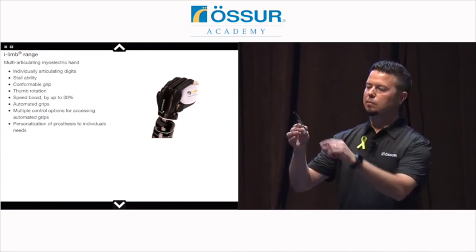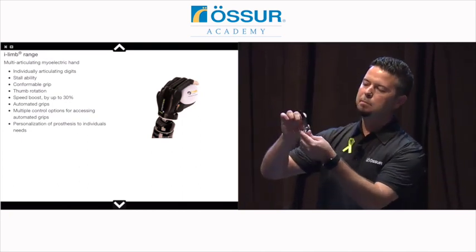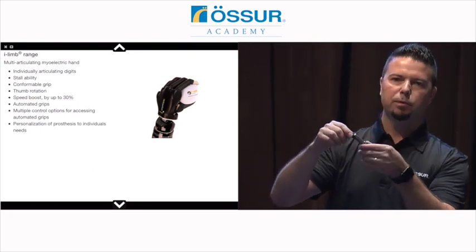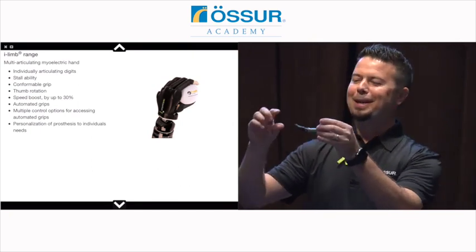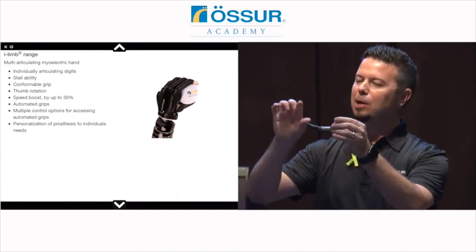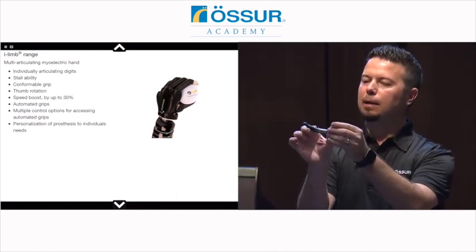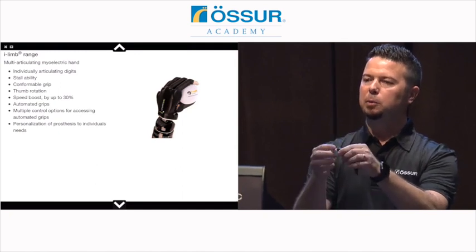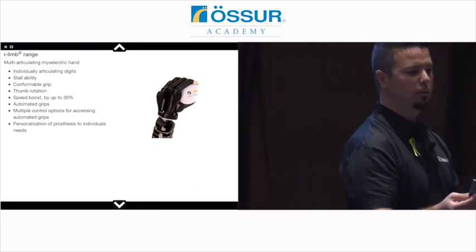So that's the original, and then I'm going to pass around the latest, and you'll notice some redesigns. We have an aluminum base, titanium base on the finger as well. This one is not meant to be taken apart. If you do take it apart, please put it back together. If you brought a toolkit or something. But same concept, still has that tip and a motor sleeve with that transmission and the gearbox, and then that aluminum base for more structure and robustness.